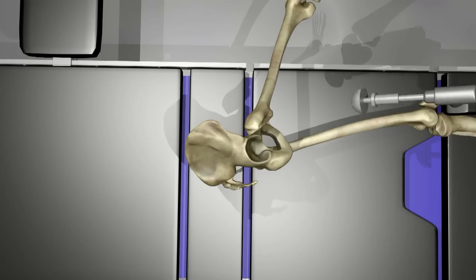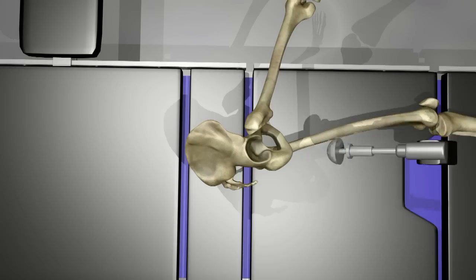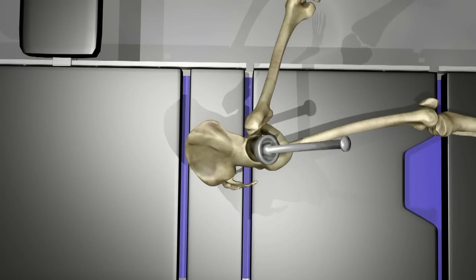The arthritic surface of the acetabulum is removed with a reamer. This prepares it to receive the acetabular component of the new prosthesis.